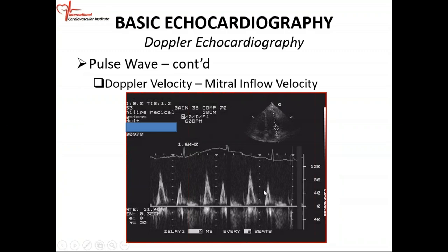Let's look at our mitral inflow. We have our apical four-chamber view with two-dimensional echo on top. This is the cursor, and the sample volume is right here. Your transducer is represented by this symbol. We press our pulse wave Doppler button. Blood flows from the left atrium across the mitral valve into the left ventricle in diastole, and that blood is flowing towards the transducer. That is why in diastole you have your E-velocity and then your A-velocity — this is the mitral inflow. The flow is above the baseline and occurs in diastole.